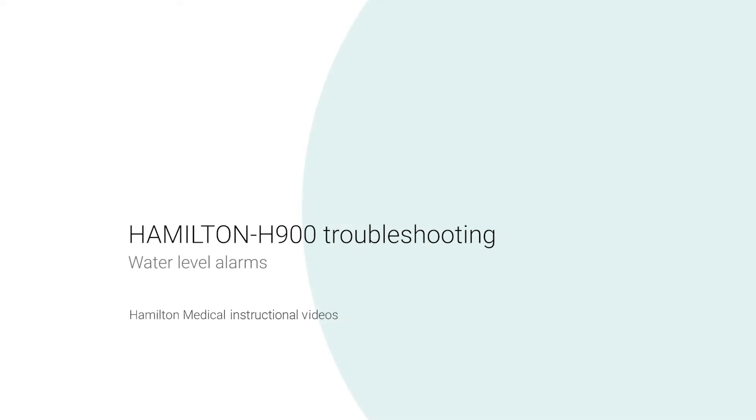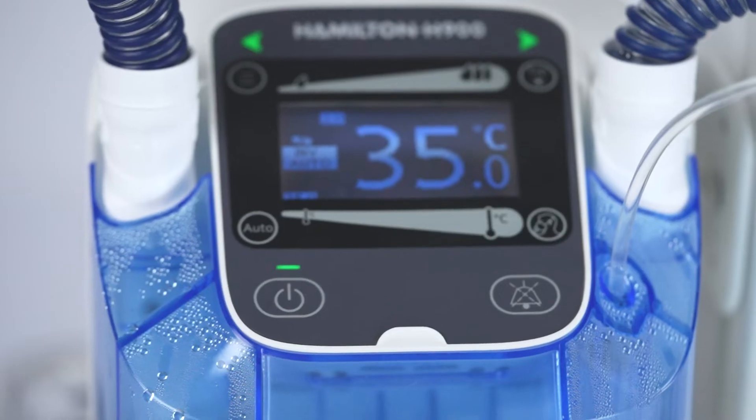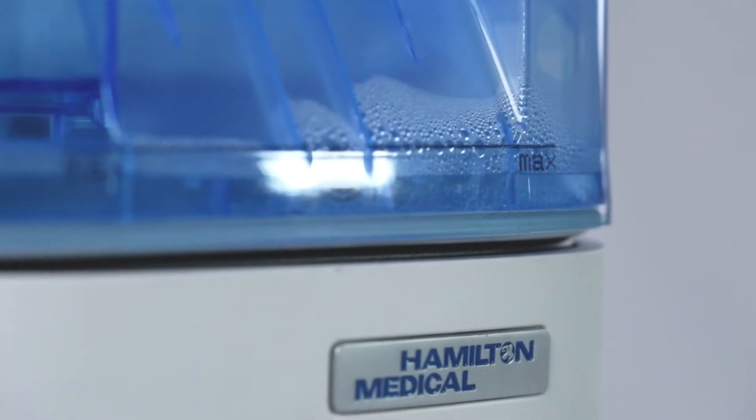Hamilton H900 Troubleshooting – Water Level Alarms. The Hamilton H900 Humidifier has various alarms to notify you of device-related conditions that need your attention. In this video, we look at water level alarms.